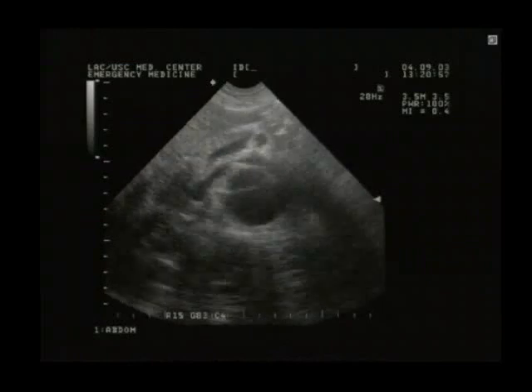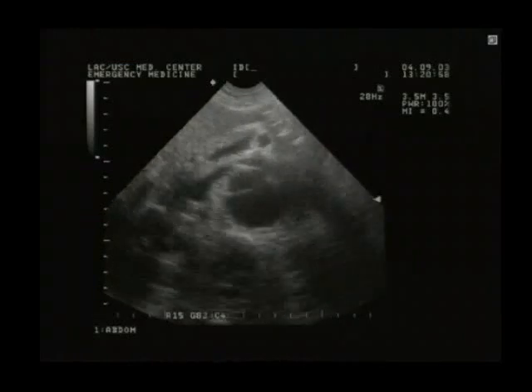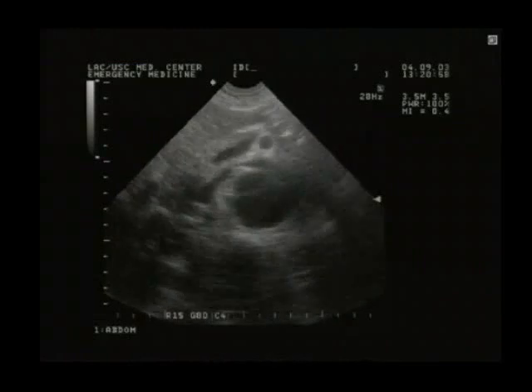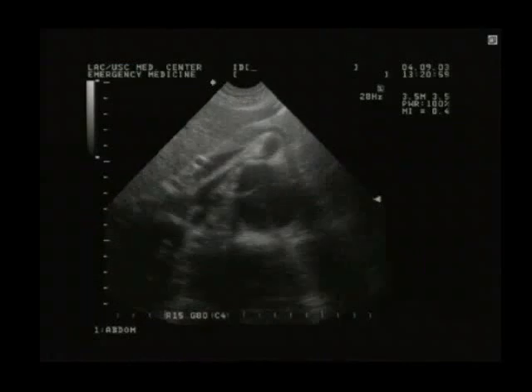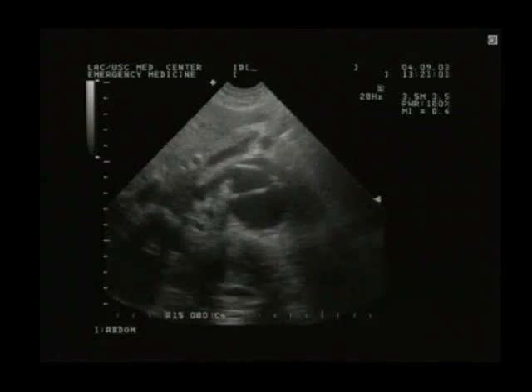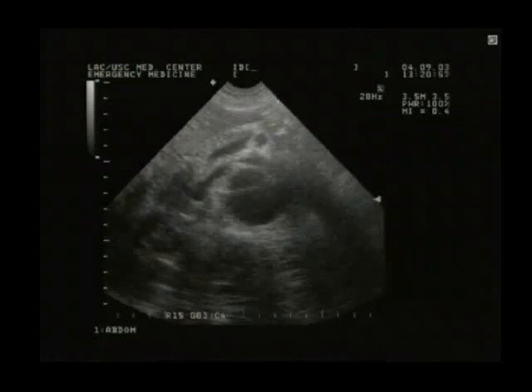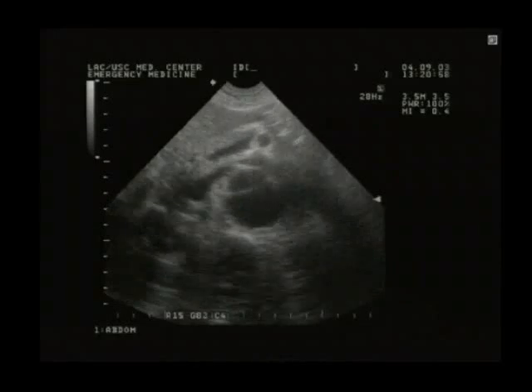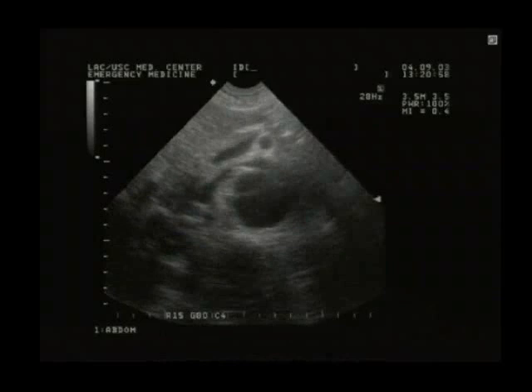But just so you recognize that, hey, there does appear to be maybe 2 lumens here. Okay, so if you want to get a little fancy, you could put flow on and actually see if there are 2 different lumens. Because obviously, if this is a dissection from the thoracic aorta, you might be calling a different surgeon, right? You're going to call a thoracic surgeon rather than a vascular surgeon. It's a different pathology. It can be treated non-operatively, etc.